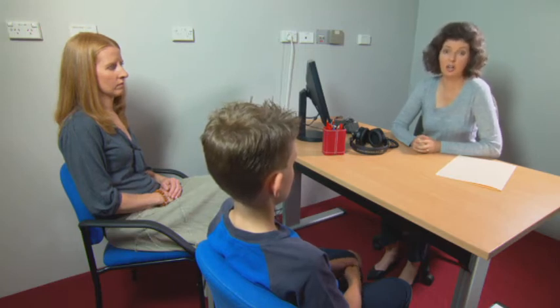It's essential that the child hears the right instructions in exactly the right words. These instructions can also be found in the help menu. You're going to hear some sentences over these headphones. The sentences are said by a lady called Miss Smith. Miss Smith will sound as if she's standing just in front of you. There'll be a beep before each sentence, so you'll know when it's about to start. Your job is to repeat back the sentence that Miss Smith says. I'll pretend to be Miss Smith, and I want you to repeat the sentence you hear. The dog had a bone. What would you say? The dog had a bone.